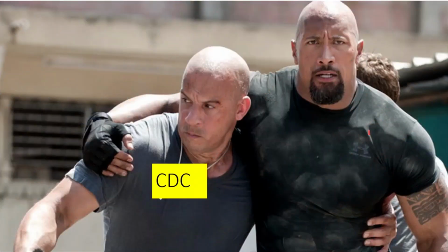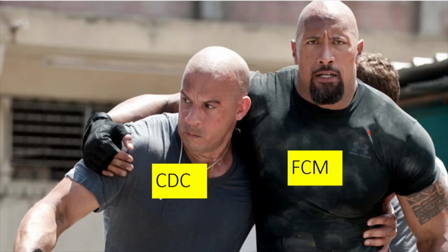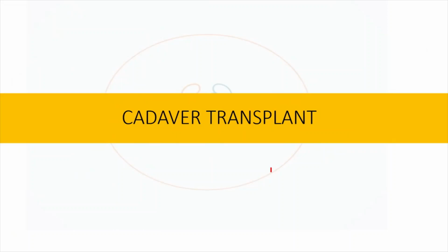So CDC and flow cross match are like adjuvants to each other. This is detecting complement mediated antibody. It is detecting non-complement mediated antibody. Double check, supporting each other. Just like the pic shown there, they are just adjuvant. But without flow cross match also, can the transplant proceed? Yes, we can proceed with the transplant, but we are double checking. That will be very clear once you see this concept.